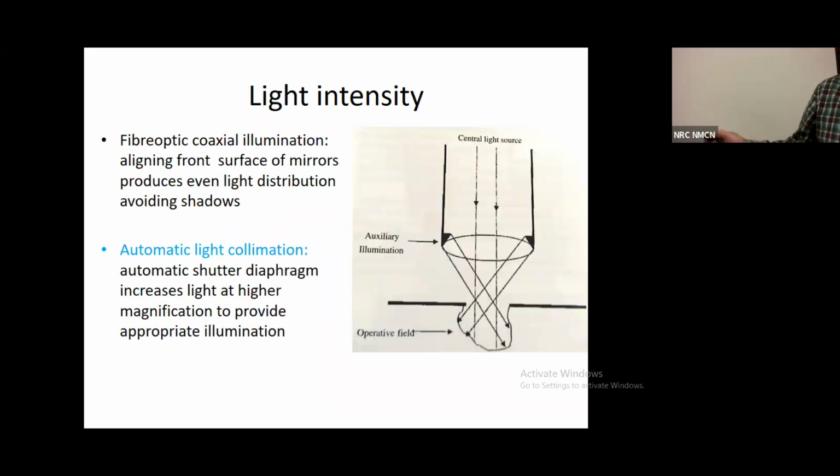Now this is further of the coaxial system. Coaxial systems work very well if it is a proper cavity. Proper cavity means a spherical cavity or a square cavity, that is fine, but that is never seen in an operative field. You always get irregular cavities. Say for instance the tumor has been removed here, and this is a very irregular cavity.